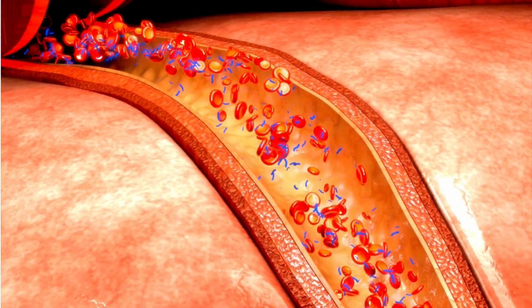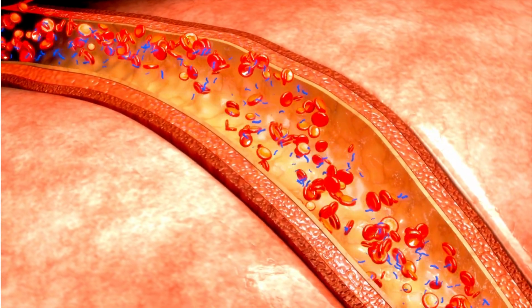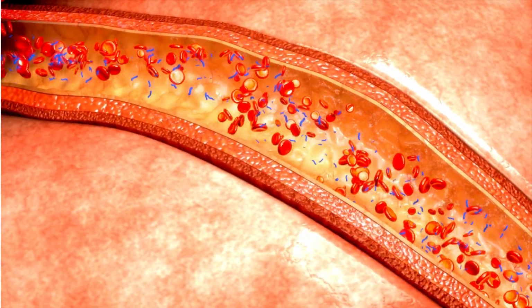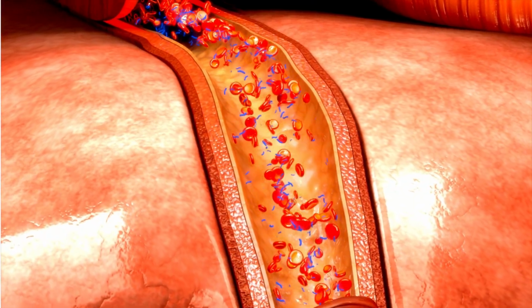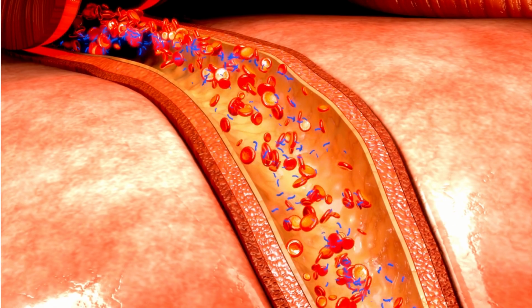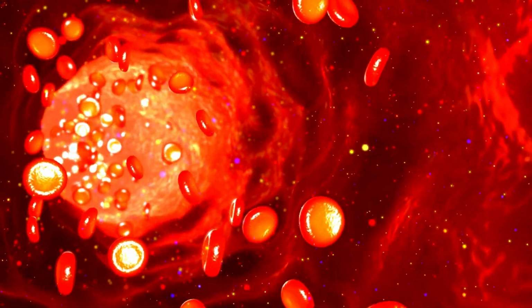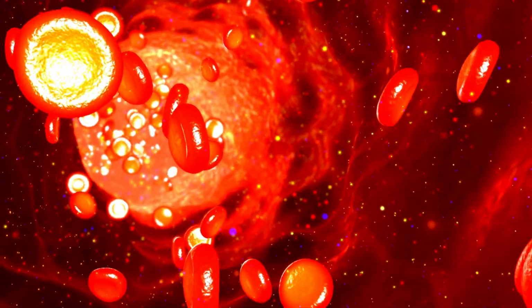It's a challenging task, and it's very hard to say that you are skillful. Even skillful people still face a challenge in inserting the device properly, whether in selecting the vein, the way of entering the vein, or the way around the patient during insertion. And we should remember that the condition of the patient is not optimum, right? Because he's a patient in need of this device, his health condition is challenging, right? So this adds further challenge for the staff during insertion of the cannula.